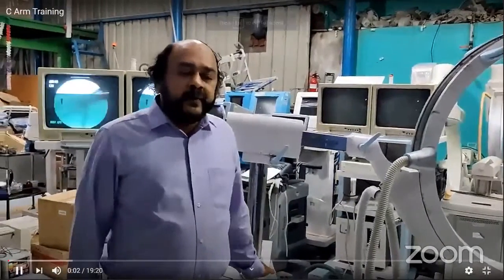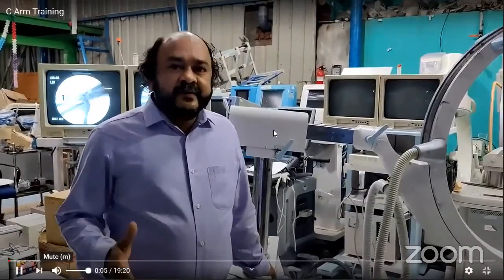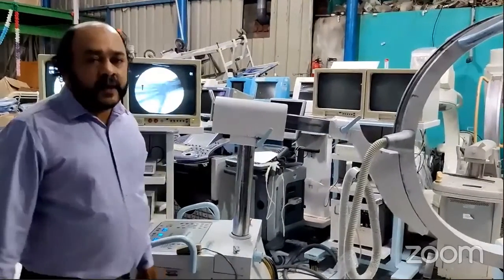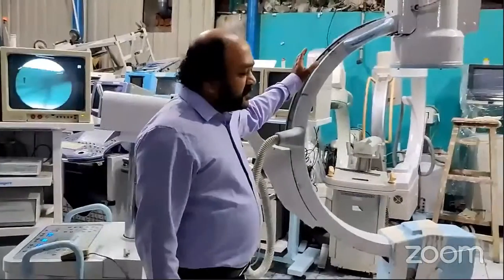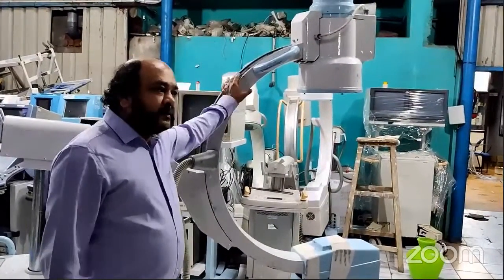Good afternoon, everyone. Today we are going to talk about the C-arm classes. First thing, what is C-arm? Why is it named C-arm? Because the shape is a C type of shape. That's the reason it is called a C-arm.